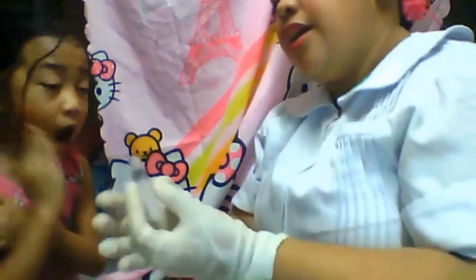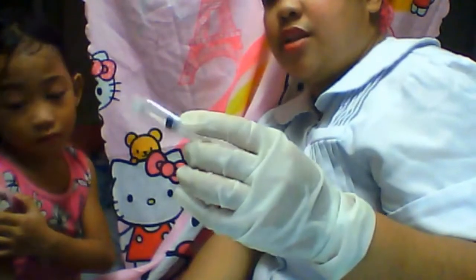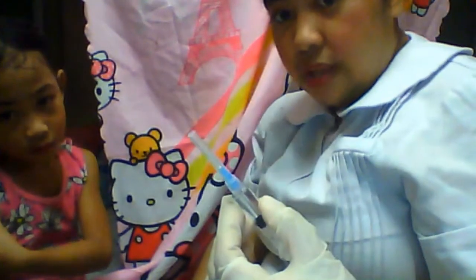So if the IM is this one, 90 degrees, the subcutaneous would be 45 degrees, like that. And you do not insert the whole needle, just halfway through, because we want to make sure that we will be going into the fatty area and not the intramuscular.